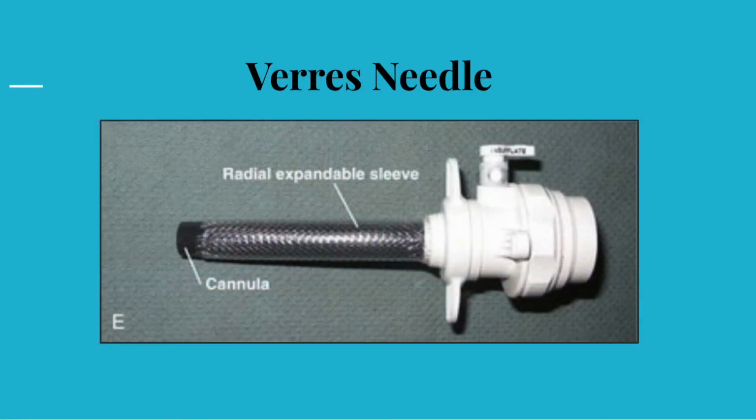The apparent advantages of a radially expandable system include less abdominal wall trauma due to a smaller fascial incision compared to a non-dilating trocar system, and omit the need for suture of the fascia defect incurred by the device.